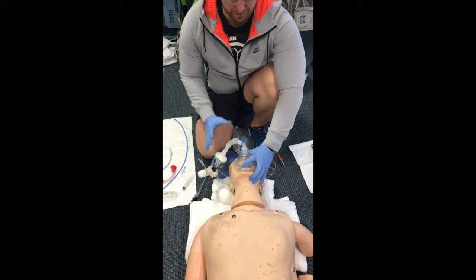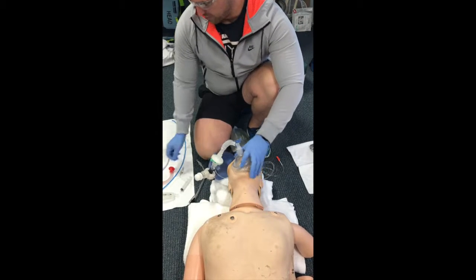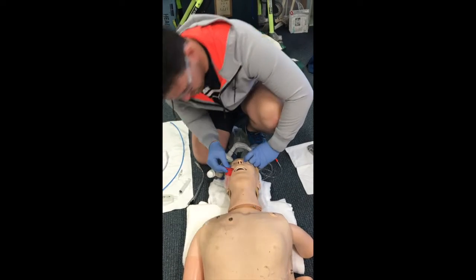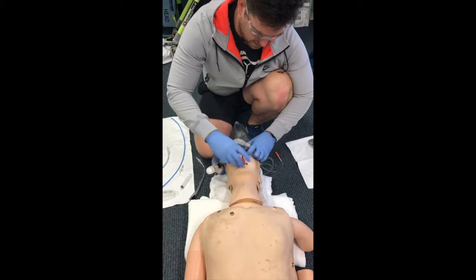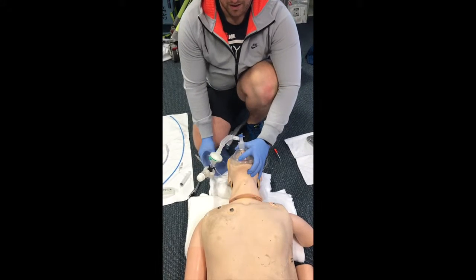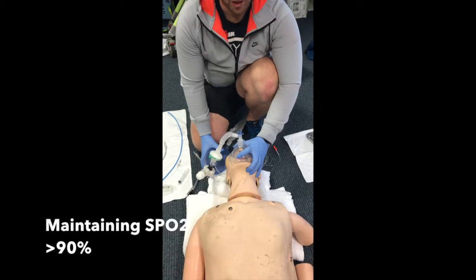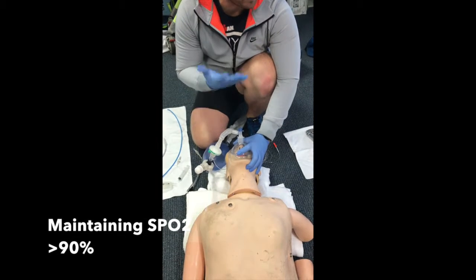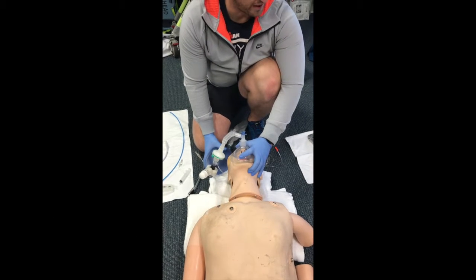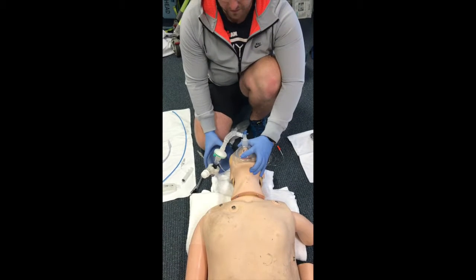Now I need to resort to the first step in the failed intubation drill, which is Goodell's airway. Measure it up, corner of the mouth to corner of the earlobe. Place that in, and with BVM. Now what I'm looking for is rise and fall of the chest. I want to see some increase in the SpO2, and I'm also looking at end tidal readings also.